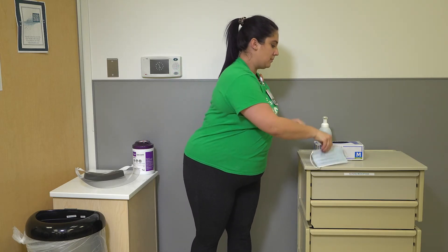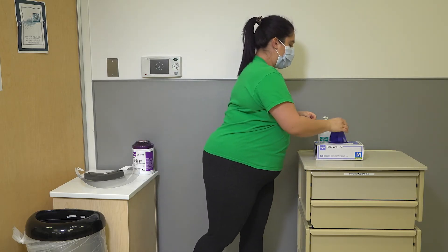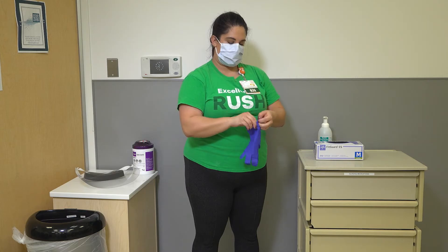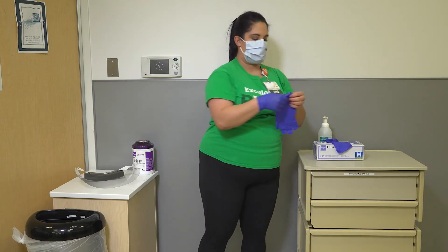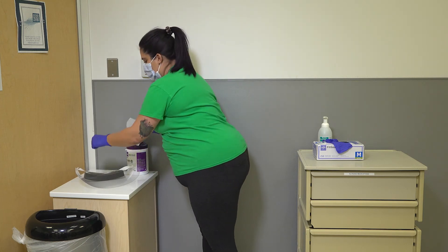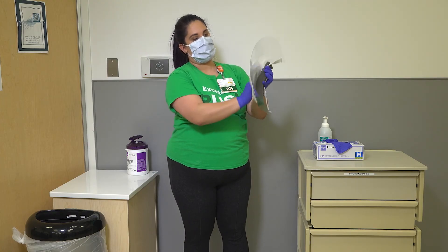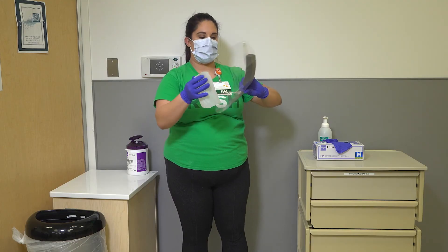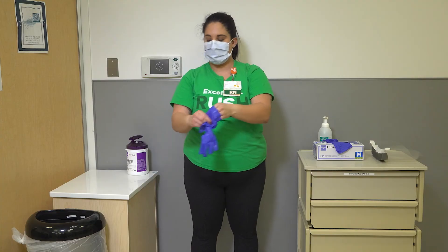Don a new regular surgical mask as indicated per universal masking protocols. Perform hand hygiene and don new gloves before cleaning your face shield or goggles. Clean your face shield thoroughly at the front and back using a PDI wipe, then set clean PPE on a clean surface. Perform hand hygiene again.